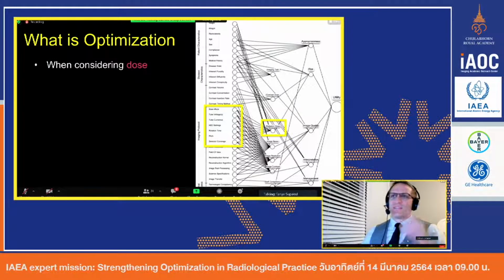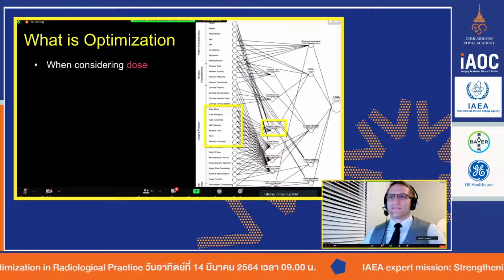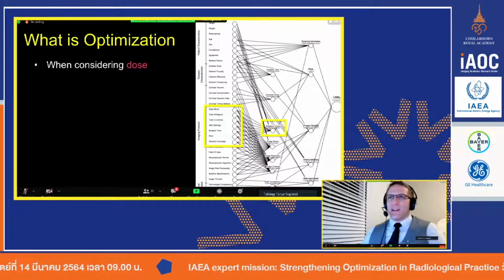This is a good point because I didn't know about this before. I didn't know why image quality is so poor in the lower C5 or so, but I didn't know it was because of the dose, and that we need to scan from the bottom up.